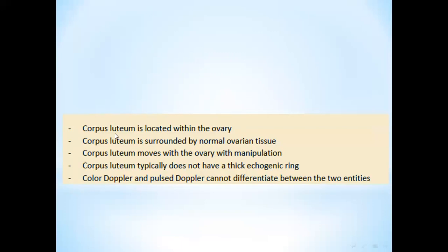First, the corpus luteum is located within the ovary and is surrounded by normal ovarian tissue — unlike an ectopic pregnancy, which may be adjacent to the ovary but is not surrounded by ovarian tissue. Corpus luteum also moves with the ovary on manipulation.